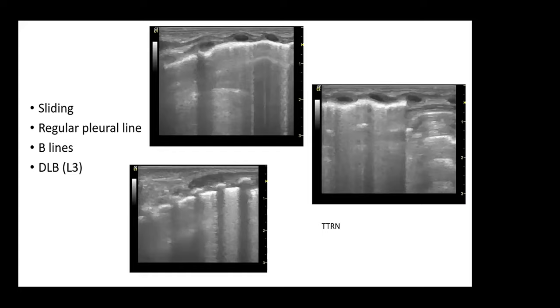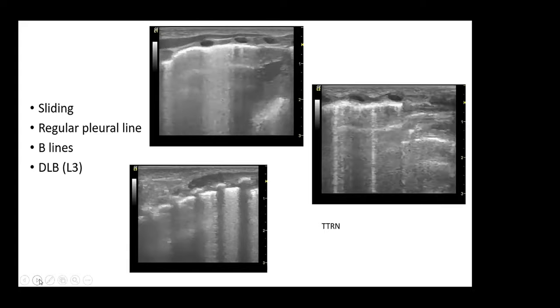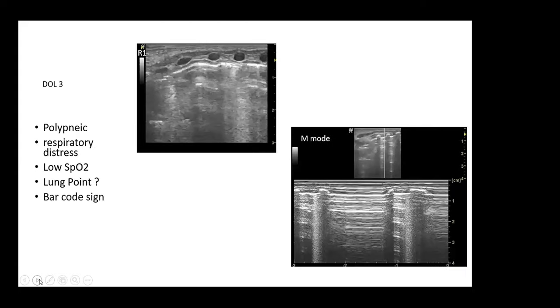So I guess for the clinical and the ultrasound, it was a transient tachypnea of the newborn. But the day after this, at 6 a.m., the baby gets worse with polypnea, respiratory distress, not saturating well. And I was on duty and did the ultrasound.